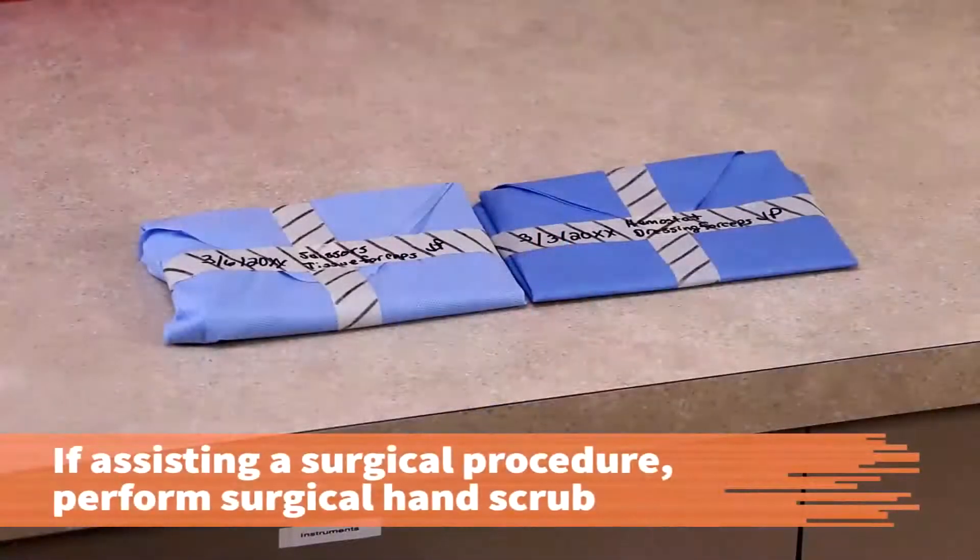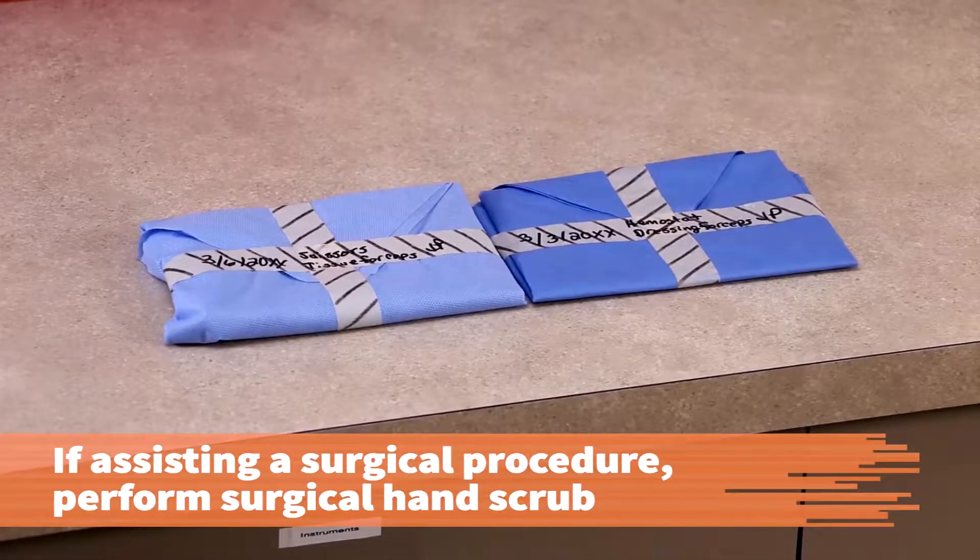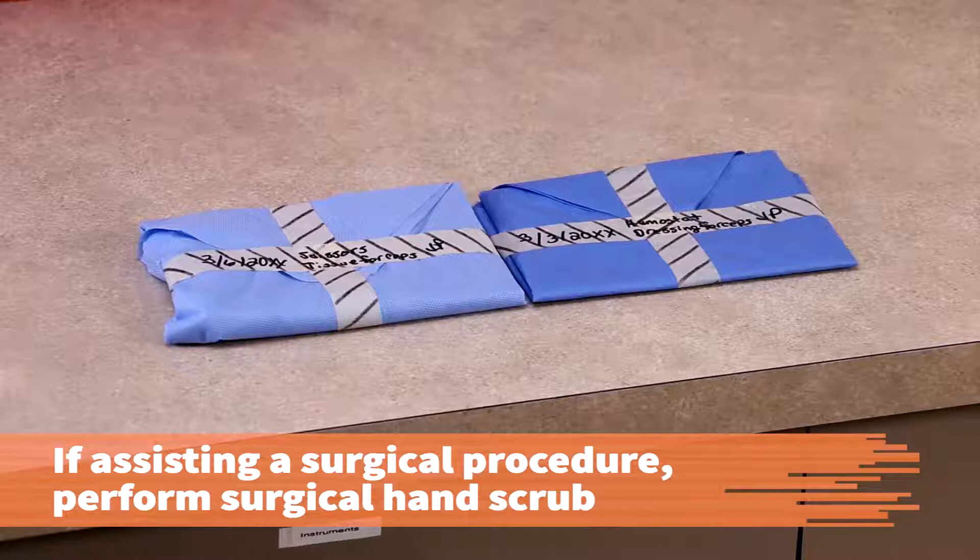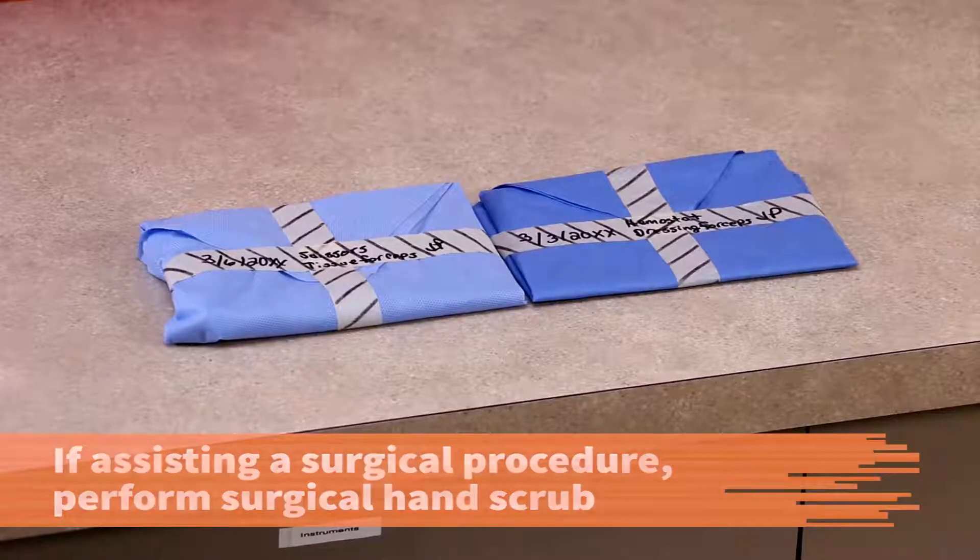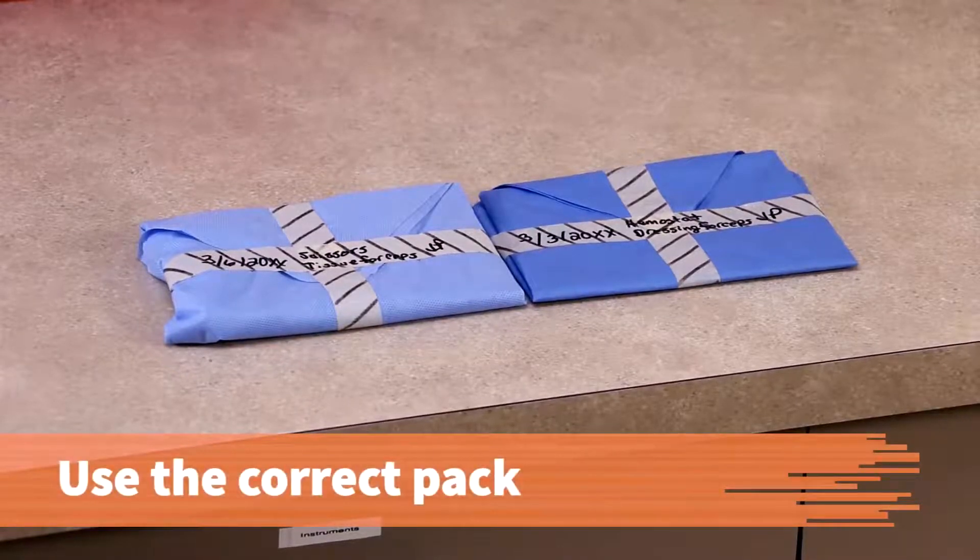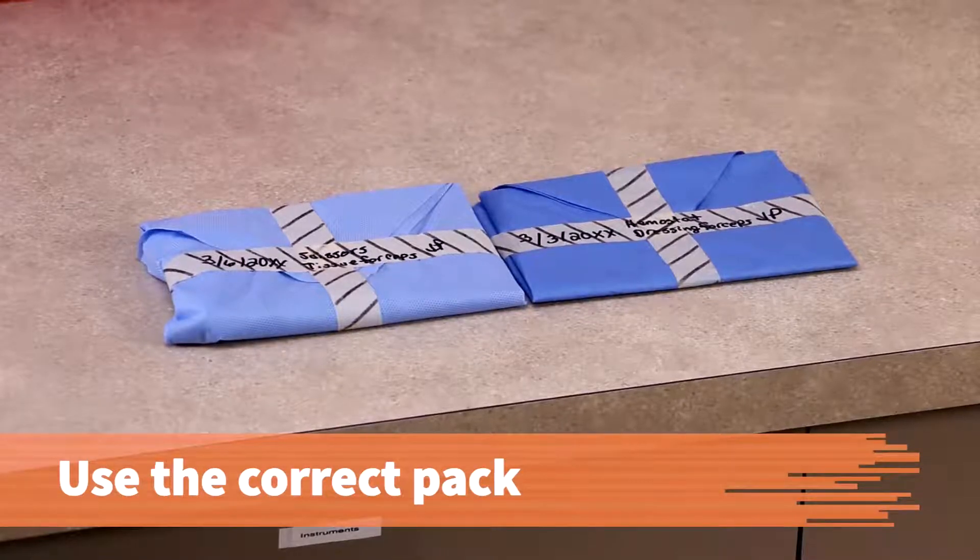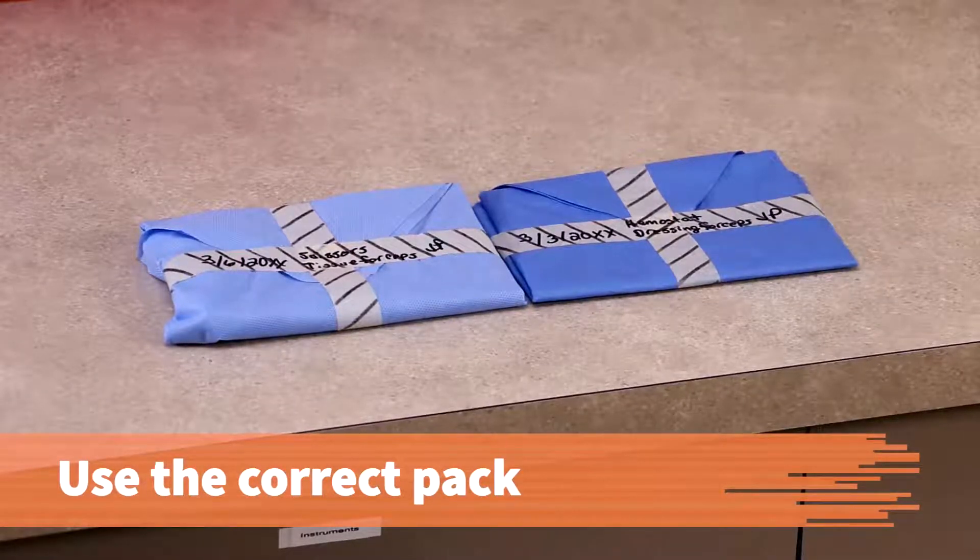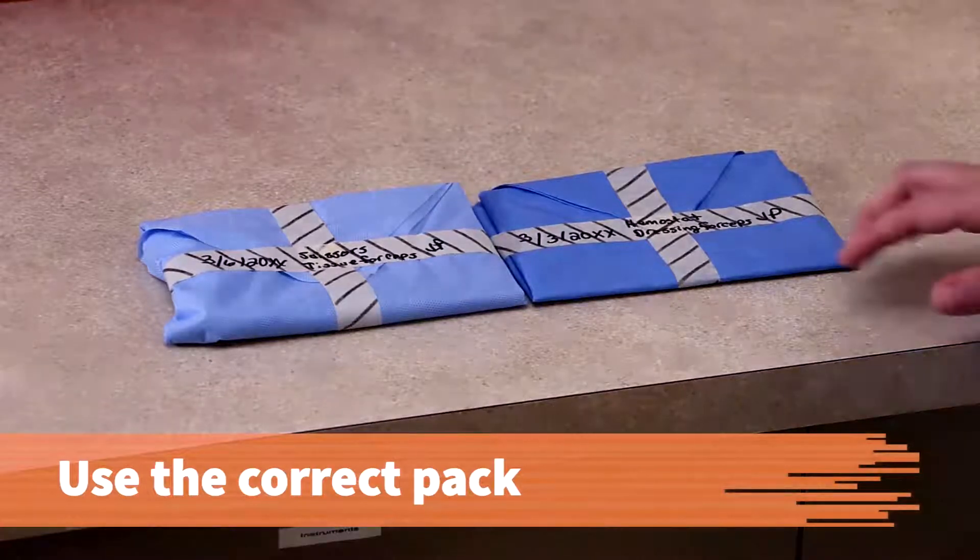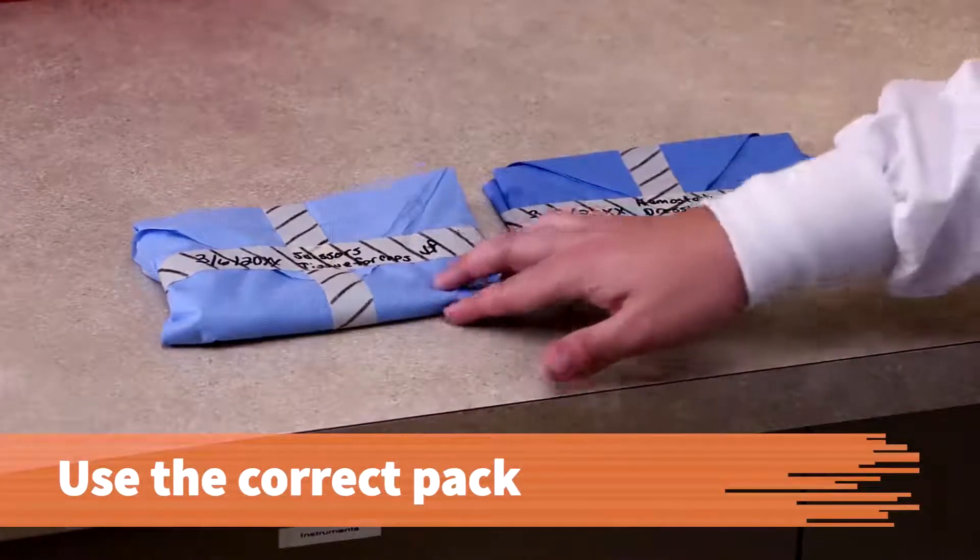If you will be assisting with a surgical procedure, immediately after opening the instrument pack, perform a surgical hand scrub. Most medical offices have a limited number of autoclaved packs, so be sure to open the correct pack. Opening the wrong pack could mean not having enough sterile supplies for the next procedure.